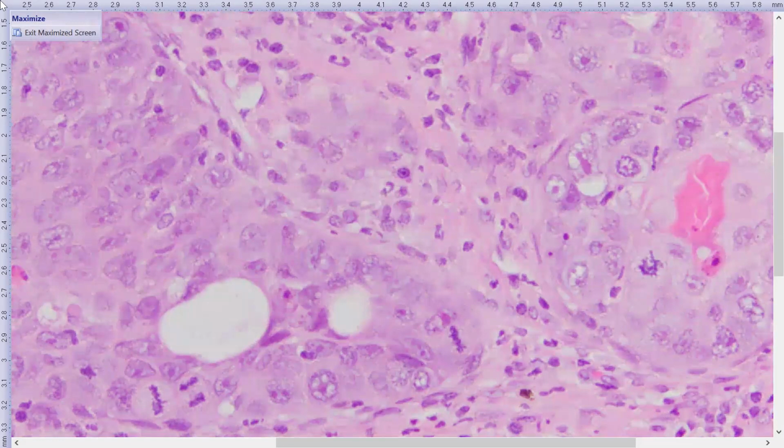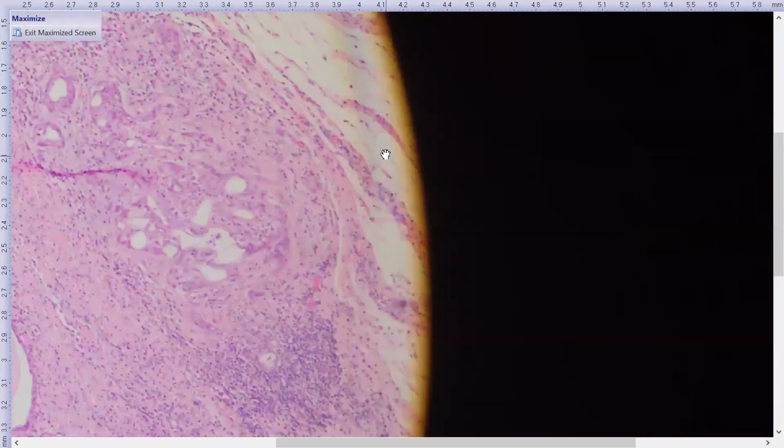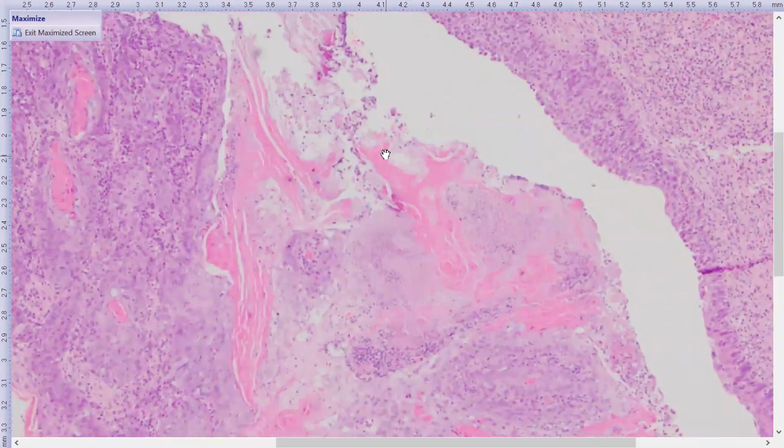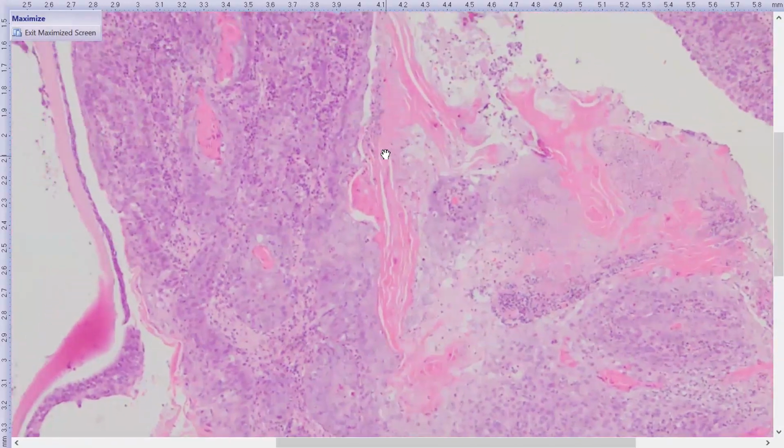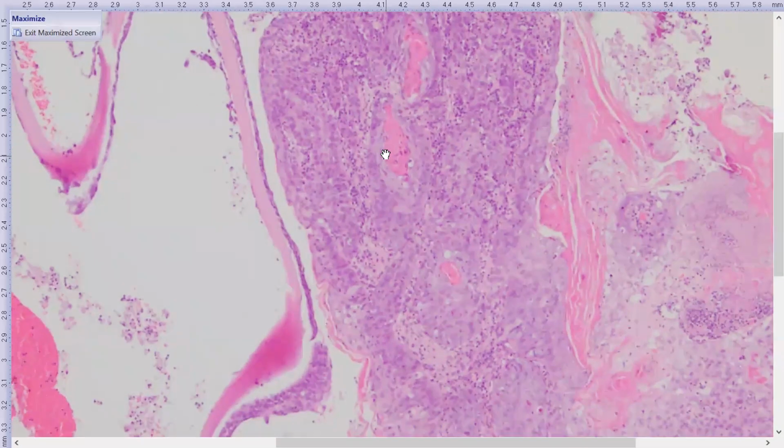They have a medium amount of eosinophilic cytoplasm. There's a large number of mitotic figures. Lots of mitotic figures everywhere. There's a really significant nuclear pleomorphism. And then often at the center of these lobules, we get this anucleate brightly eosinophilic material, which is keratin. Sometimes they form kind of discrete pearls, but basically we've got keratinization in the centers of a lot of these lobules of cells. So this is a carcinoma with squamous differentiation.